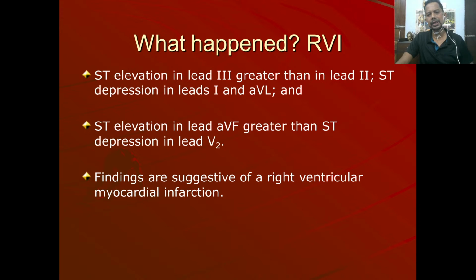What you will see in right ventricular infarction, there will be ST elevation in lead 3 which is greater than in lead 2, and you will see ST depression in lead 1 and AVL.